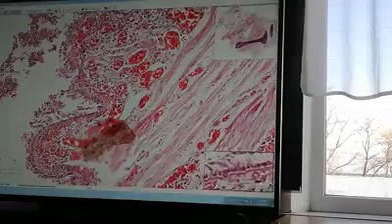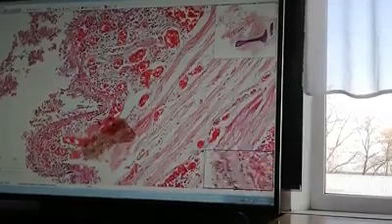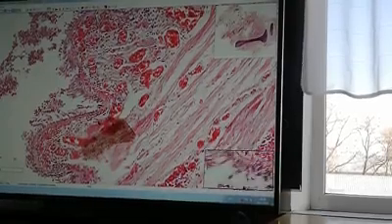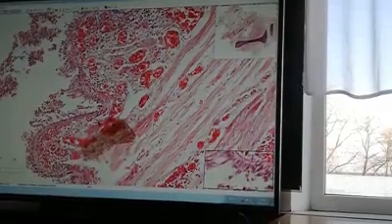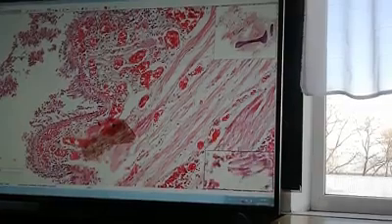So only one type of epithelium to another type. Normally we can find columnar epithelium here, so this area has normal epithelium lining, but in that area we can find the beginning of squamous cell metaplasia, when columnar epithelium, one layer, is transformed to multi-layered squamous epithelium. So metaplasia is here.